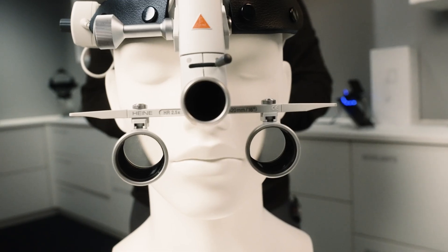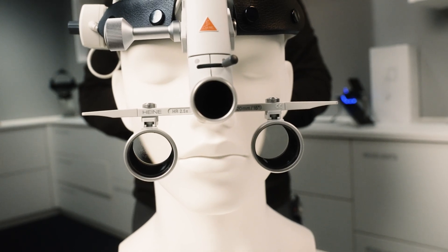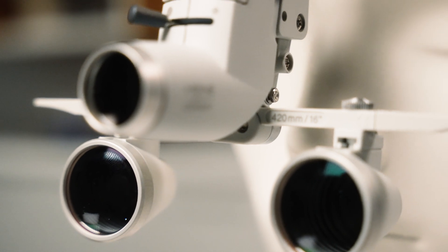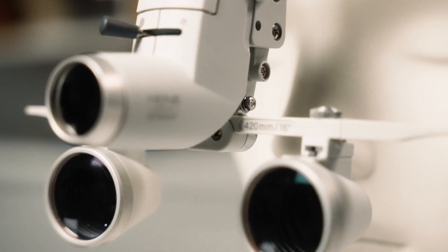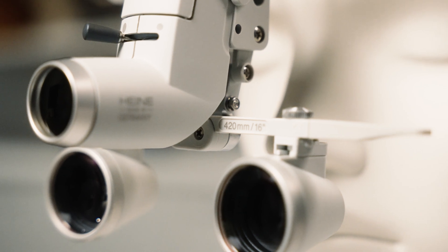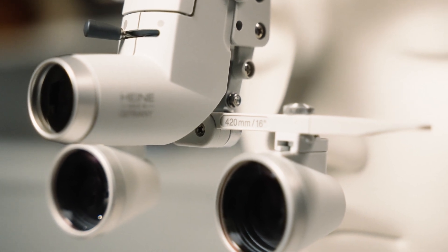Before jumping into the individual fitting, please make sure that you know what working distance your loops are designed for. You will find this information in millimeters printed on the front of the loop carrier rail. For instance, this one is set for 420 millimeters. We will need this distance later on to finalize the setup.